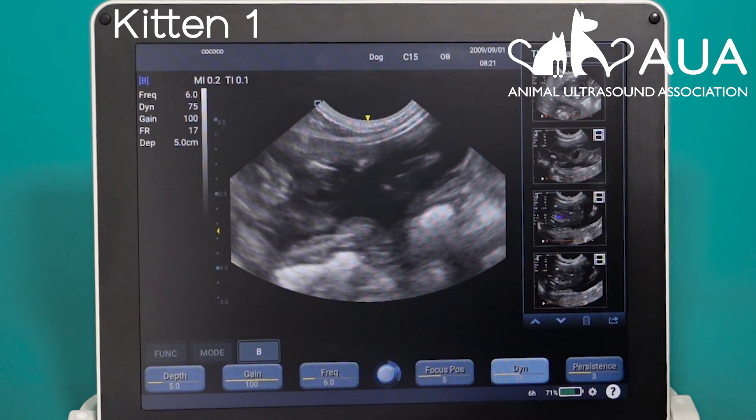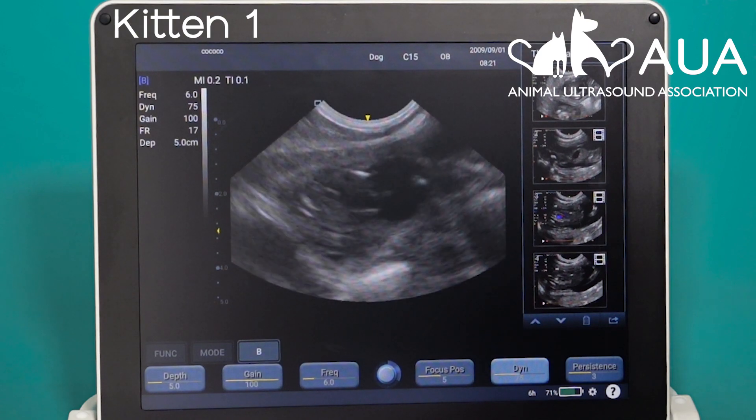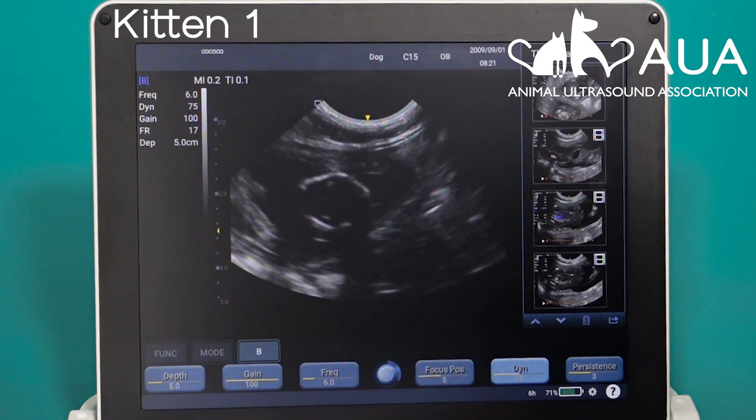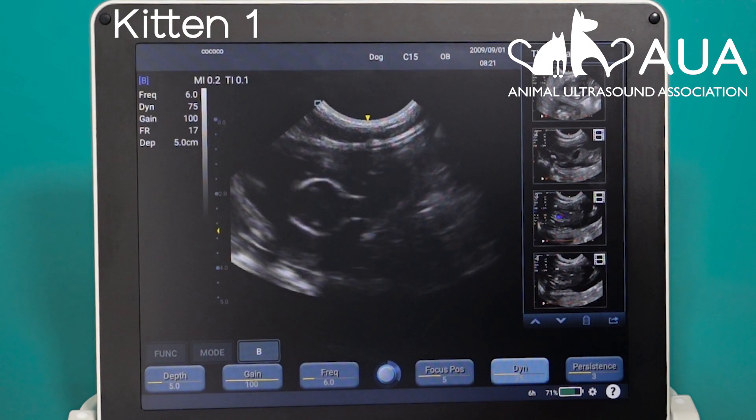Scan technique is taught extensively on our courses — check the description below for more. But once you've found your image and optimised it, try to look for the midline down the centre of the skull, and preferably, if you have a good quality scanner, the two hemispheres of the brain, so you know you're in the right place.